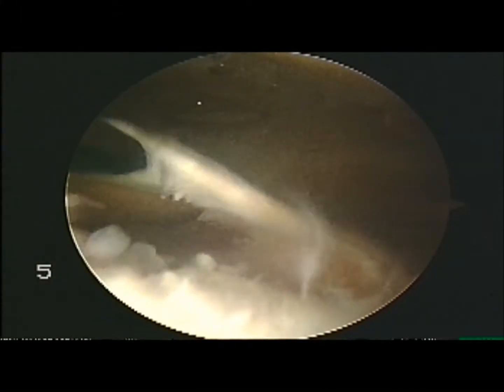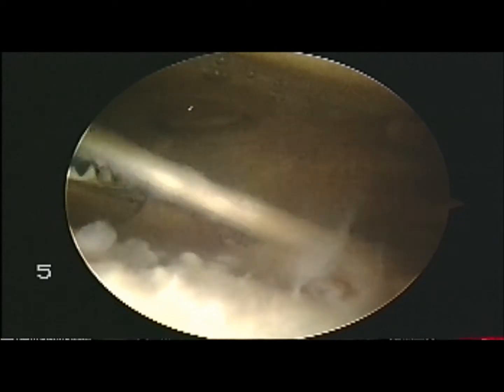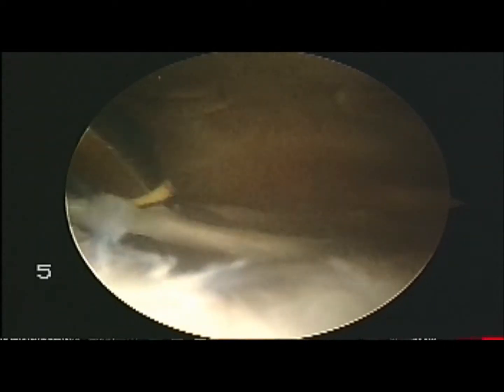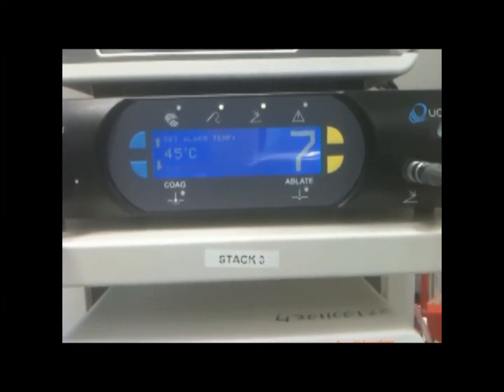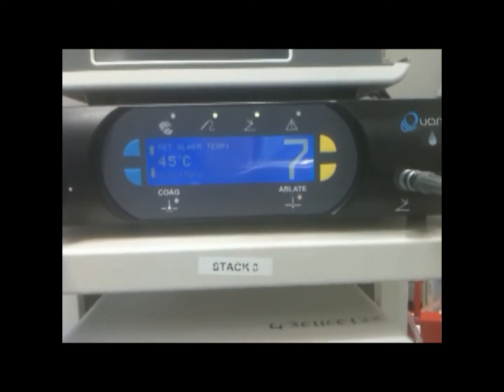Another great advantage of the ArthroCare Ambient over a shaver is that here you can see the shaver having difficulty dividing an intra-articular adhesion from bleeding, whereas the Ambient ArthroCare has no problem dividing that adhesion. It does it at a very low temperature — 36 degrees, 35 degrees, 34 degrees.